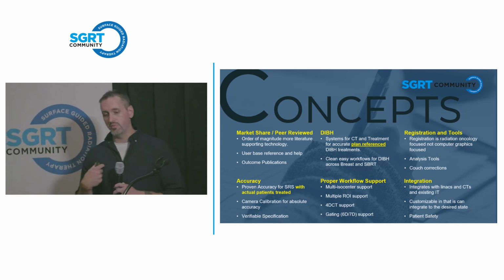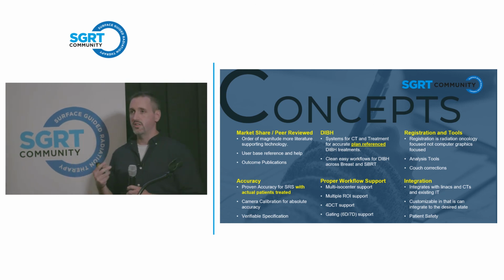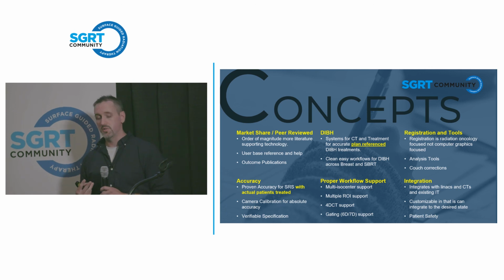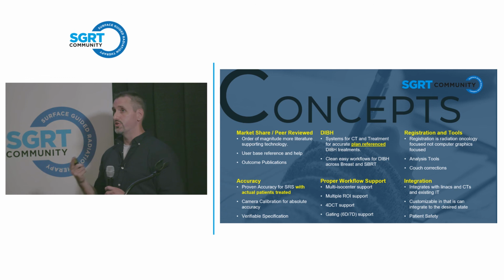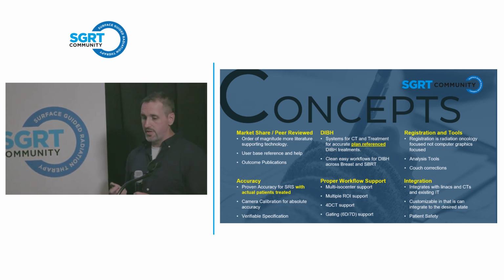Registration tools, this is the big one for us at Centura. There's rigid registration and deformable registration out there. There are consequences to those types of registration. You really need to understand what those consequences are, what that means for your analysis tools, what that means for your QA, what that means for your quality management program, because there's some information that you need to know.